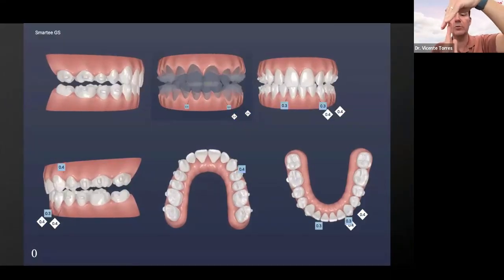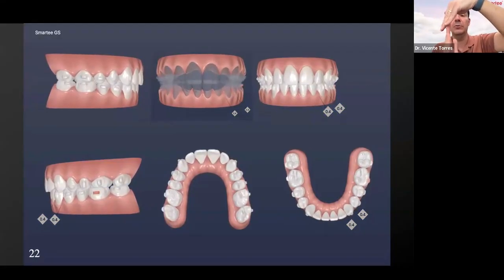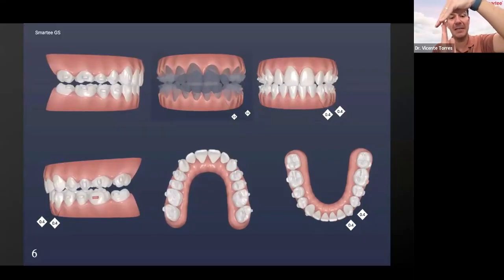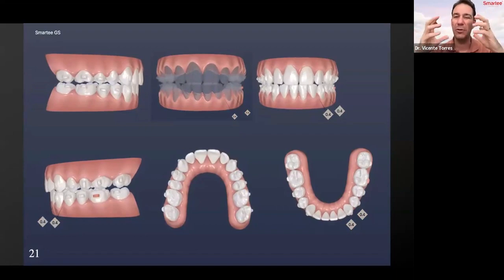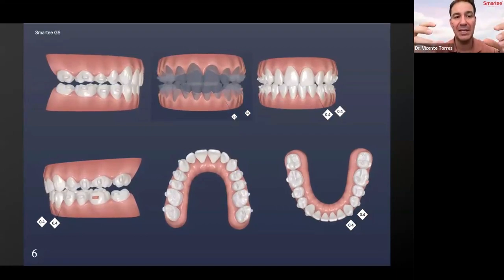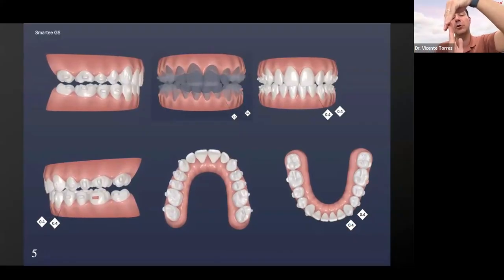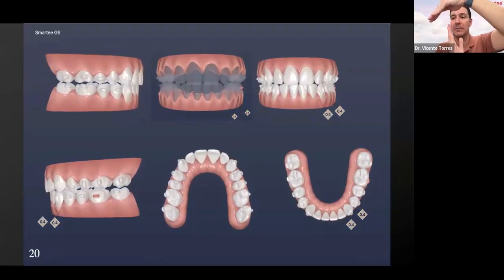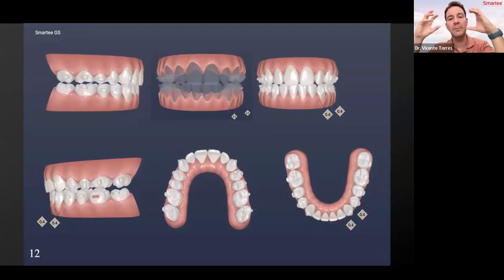I need to change the inclination of the incisors in order to remove this anterior contact, and for the mandibular, only with the attachment is enough to make this natural eruption, because it's not high extrusion, it's only changing the position. And when you correct or remove this anterior contact, the mandibular, step by step, has more movement and improves the occlusion.